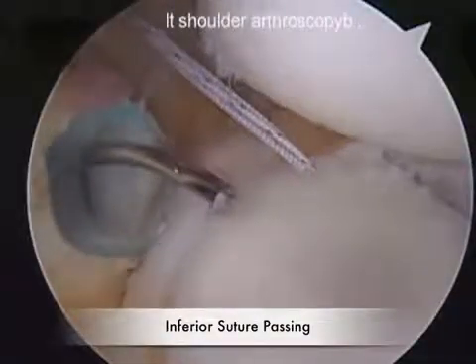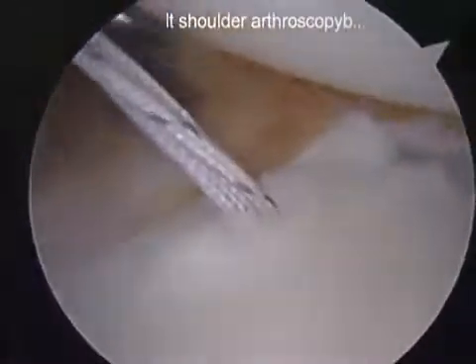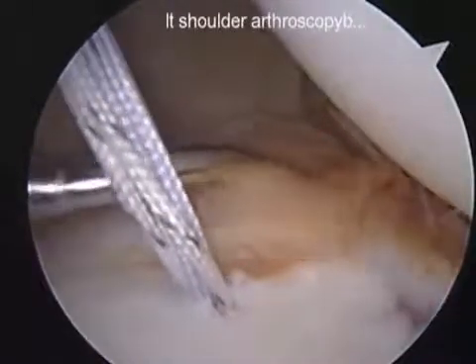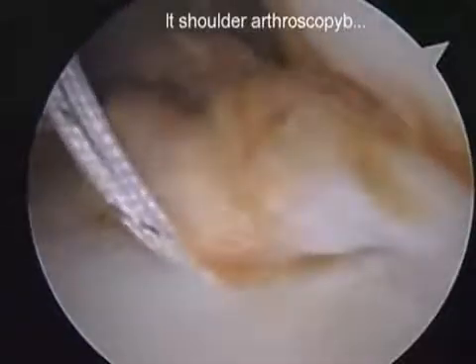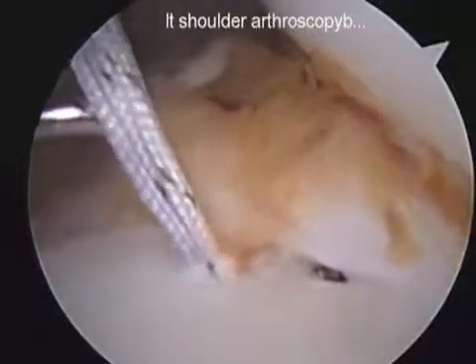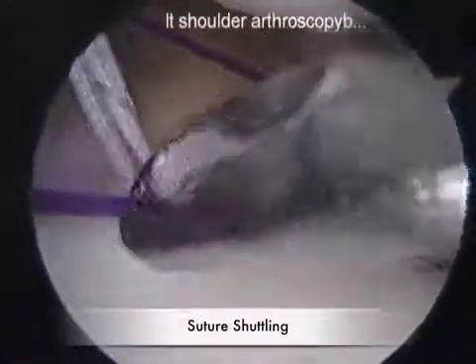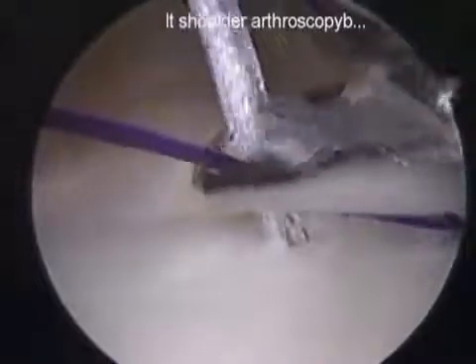An 8mm cannula in the posterior portal is used to pass the initial inferior stitch. Great care is taken with the first pass due to the proximity of the axillary nerve to the inferior capsule. The first suture pass facilitates reduction of the inferior capsular volume. A bite of the inferior capsule is taken, and the suture passer exits just inferior to the labrum.